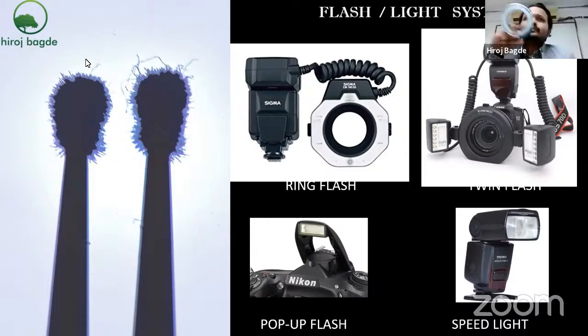Whenever I'm talking about ring lights or ring flash systems, that flash system is, the majority of the time, utilized for the posteriors, not for the anterior. So we have two areas where we need to work. Whenever I'm doing any kind of surgicals, or any type of restorative material fillings for the posteriors, ring flashes are to be preferred because they have a very round surface and cover the area where you are supposed to work. In the posteriors we have a broad surface and we don't need to show any kind of artistic work, line angles or point angles.